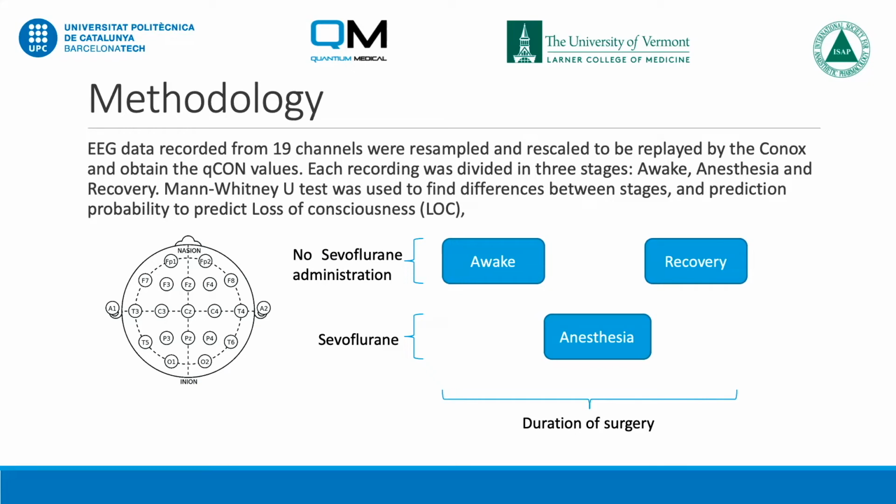As you can see, the advantage of having 19 channels is that it gives us more space to analyze different types of EEG, whereas processed EEG monitors would typically only have 1 or maximum 2 or perhaps 4 EEG channels. So it certainly is an advantage to have access to high channel EEG data.